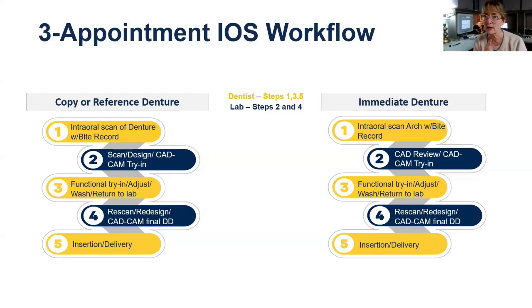Some people want to be very hands-on with the movement of the denture teeth during that try-in process. Some patients want very natural looking setup to their teeth. So the dentist's ability to move that in the operatory chairside can be very beneficial to creating a very natural setup. Other patients and dentists are not as concerned about being that hands-on with the setup itself. And in that case, you would request the functional try-in.